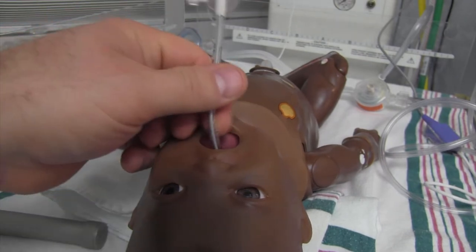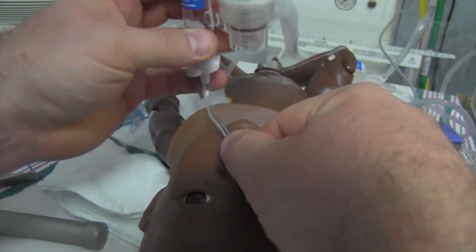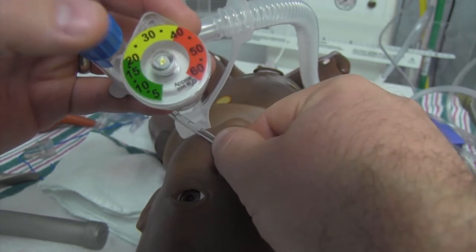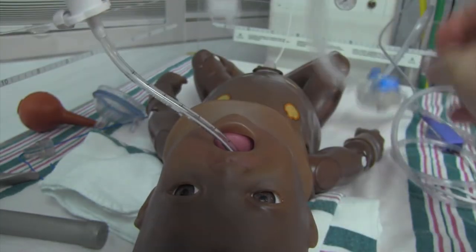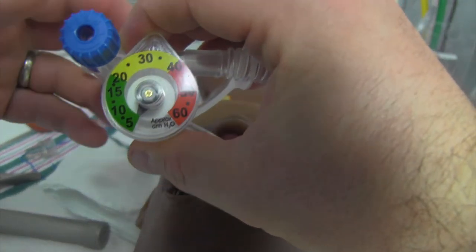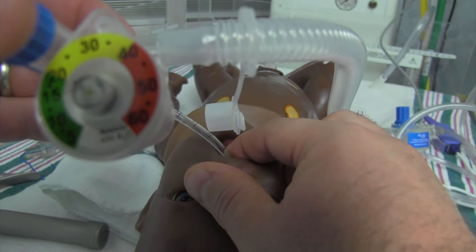If you want to see it's in the right spot, you can go in and view - you can see the endotracheal tube through the vocal cords in the right spot. Then you pop off the mask, adapt this, and when I give it, it's going up to the high pressure I set - because remember I went through MR. SOPA and added the extra pressure. Now it's sealing. Ideally I'd back this down just a little bit. Really cool - if I just adapt it, see it goes straight to 5. Now we're ventilating. Secure that tube and ventilate your kid at 20 over 5.